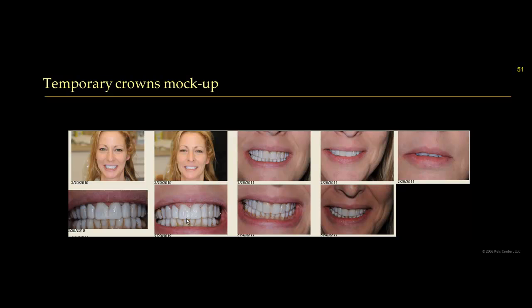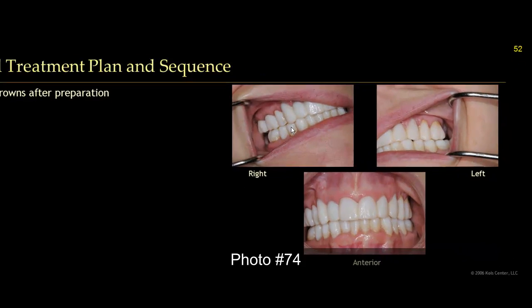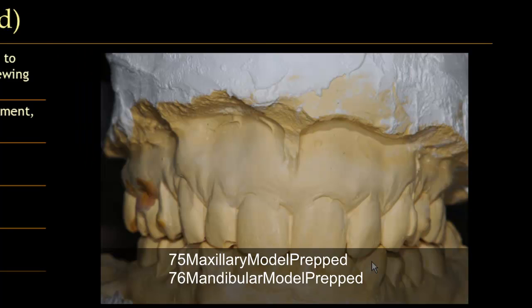She likes the shape. She feels comfortable, and that's how we proceed with the case. You can see in this picture that I prep those teeth and put them in temporaries. She's wearing those temporaries for the next probably 3-4 months. Again, I want to make sure that she is comfortable before I finish the case. Also, she started telling me that her symptoms are gone and she doesn't feel any more pain, tension, headaches, so migraines are gone. So this is a case of how we start.